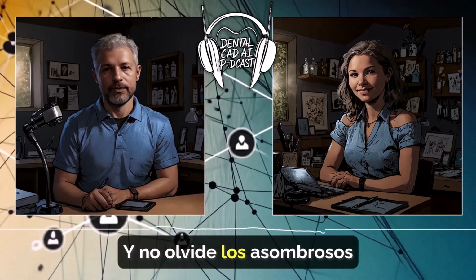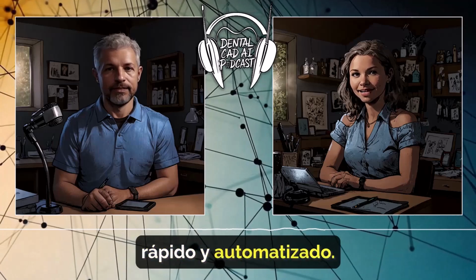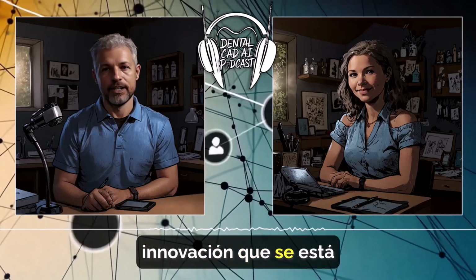Right, and don't forget those amazing advancements in denture creation. Oh yeah, that was huge, making the process so much faster and more automated. And of course, all those enhancements to model creation. It's incredible to see how far digital dentistry has come. It really is. It's a testament to all the innovation happening in the field.